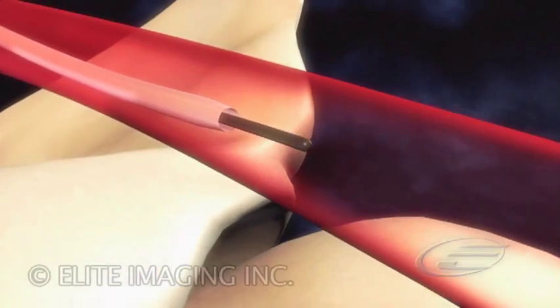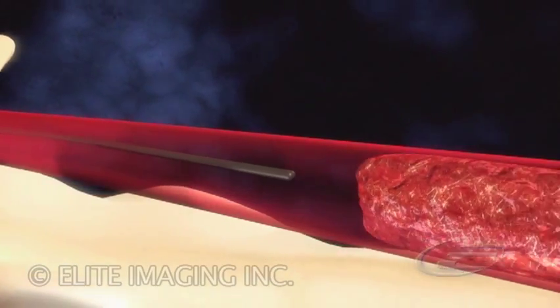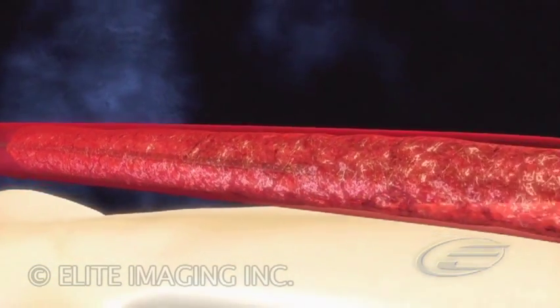Placement of a long introducer sheath provides percutaneous arterial access and is followed by placement of the guide wire through the clot.